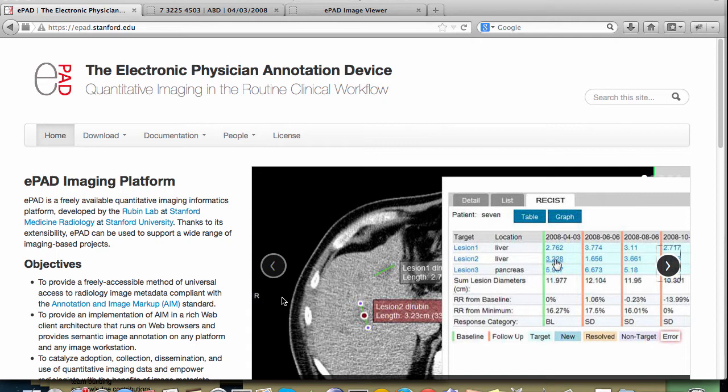The nice thing about EPAD is that it runs on a web browser on whatever image viewing workstation or computer you want to read on, whether it be a commercial PACS, your personal computer, or a tablet.